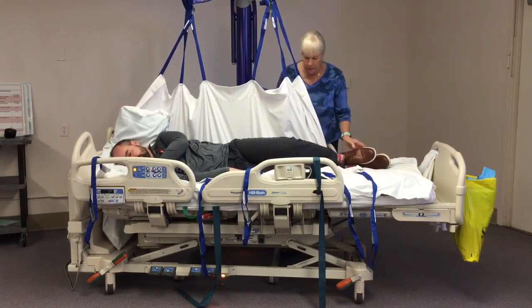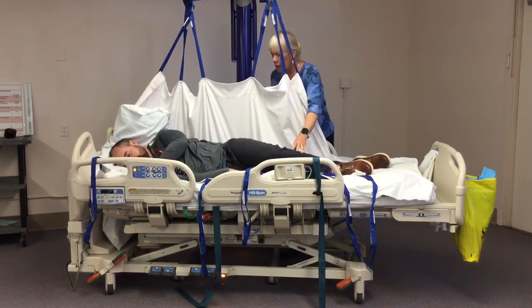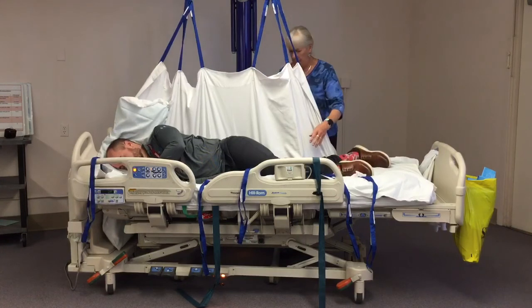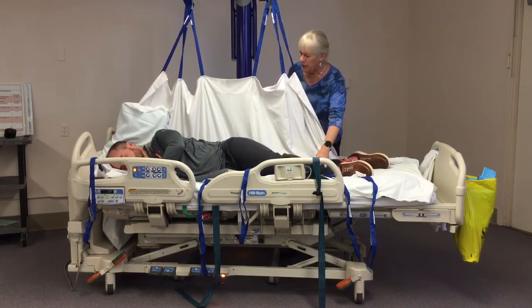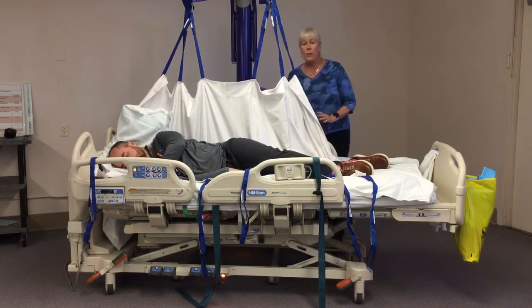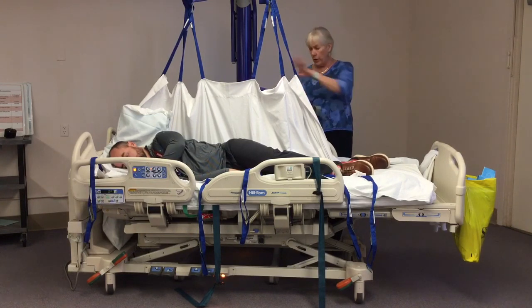So we're going to get him going in that direction. What we don't want to do is roll him over so much that he's on his face, okay? If you roll him too far, he's going to roll all the way over. So we want to roll him just enough so that he stays in that direction. Now we can shove pillows underneath him and hold him in that sideline position. When we lower the sling back down again, we also have him in the sideline position to do whatever work we need to do on the back.